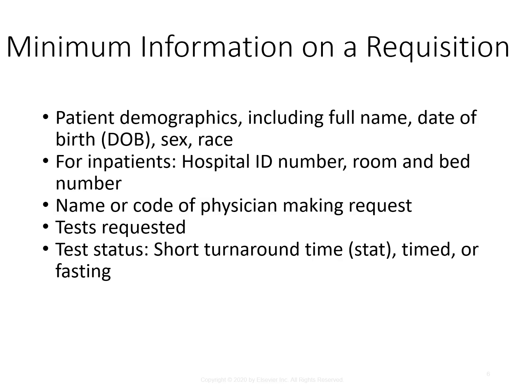You also need to have the name or code of the physician that is ordering the test. You need to have the test that the physician wants to be ordered. And then you need to have the test status, which is if they need it stat, so they need it now, or if they want it timed, let's say they want it at noon, or if they want the patient to be fasting. The physician must also provide the International Classification of Diseases code, which is the ICD-10 code. The number and type of tubes to collect may also be indicated on the requisition.